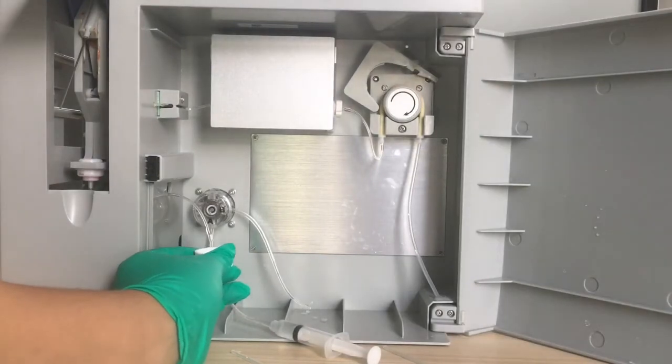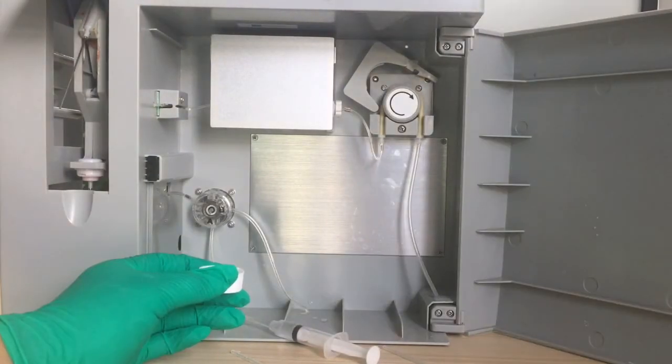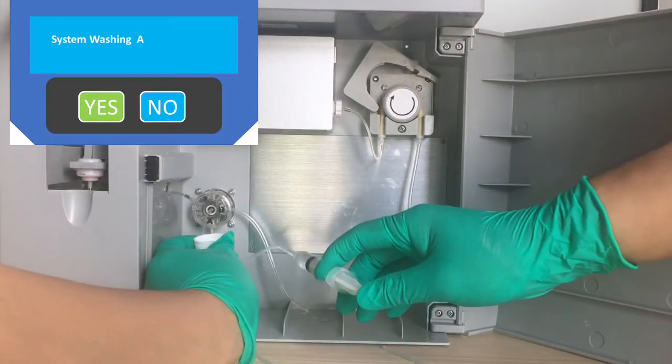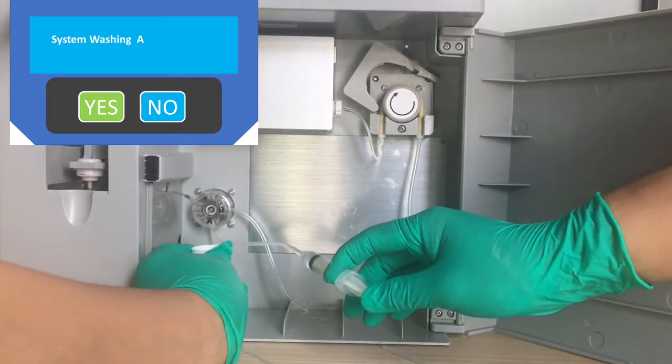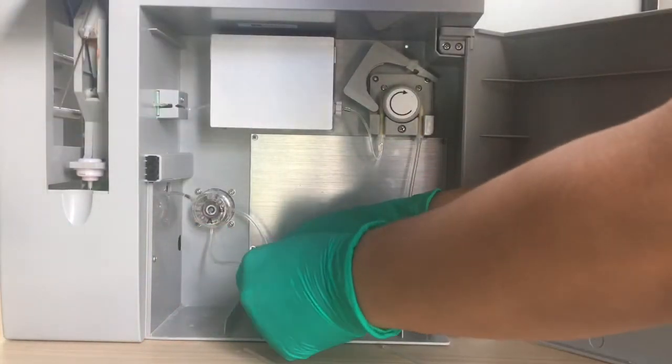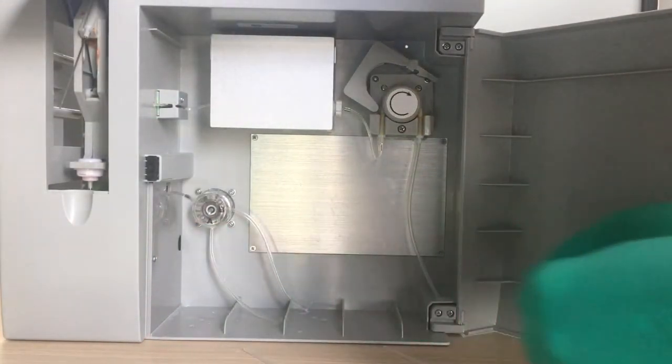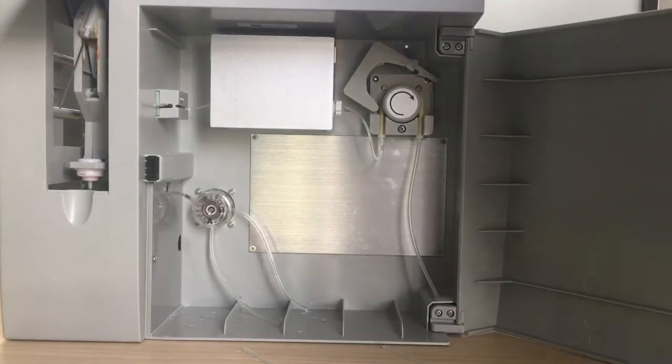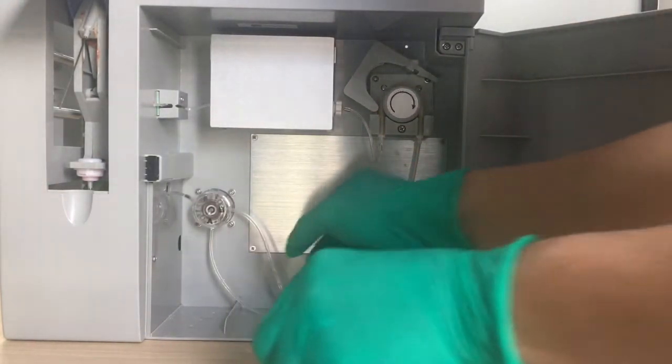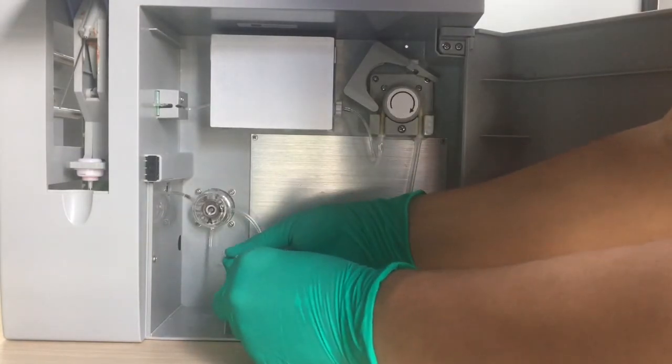Then we can wait for the system washing A. During system washing A, we can push inject water. By this way, we can make sure this part is smooth. Then we clean the water with tissue.